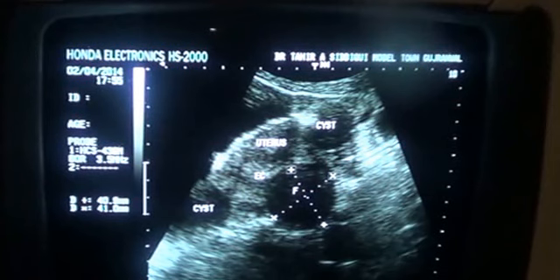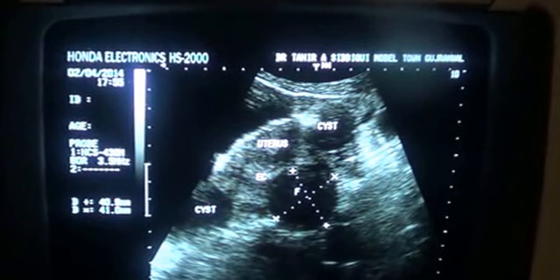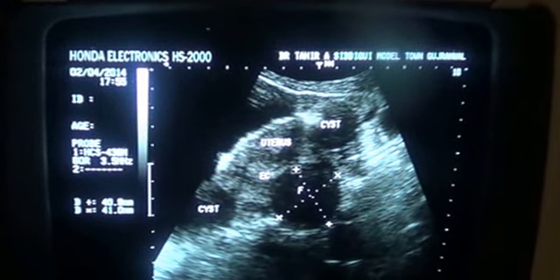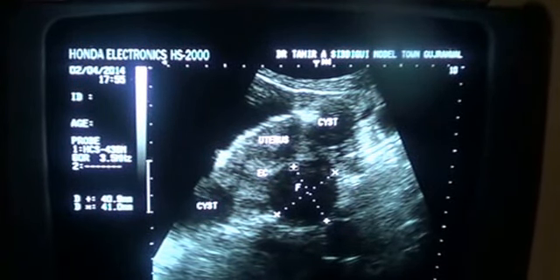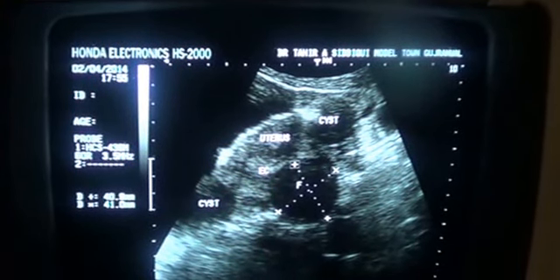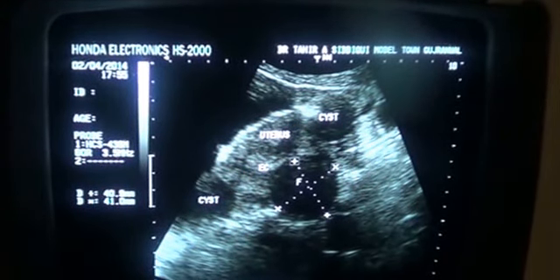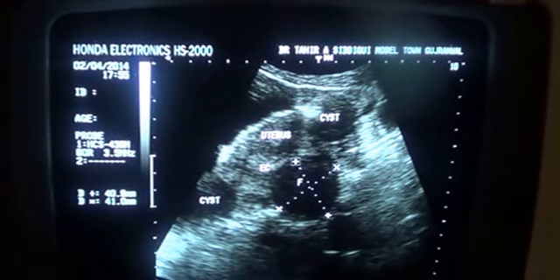So it's quite clear the cause of infertility for this female is multiple fibroids, both intramural, the largest in the posterior wall, and the rest all subserosal in location, in the anterior wall, posterior wall, and at the fundal region, with bilateral retention ovarian cysts that are full of echoes, suggestive of being either infective in nature or endometriomas. Thank you very much.